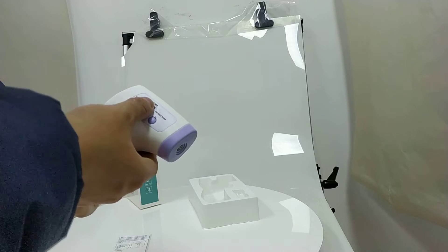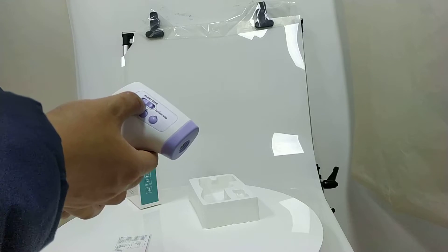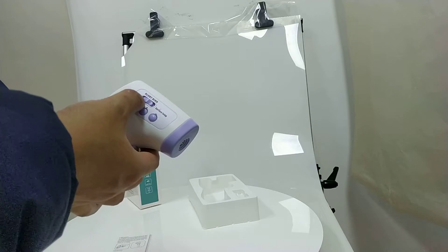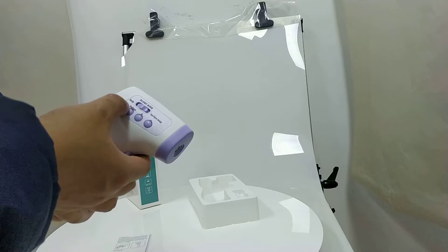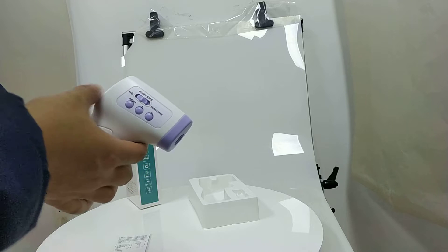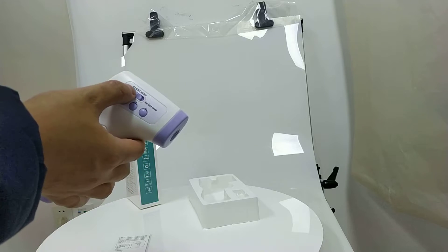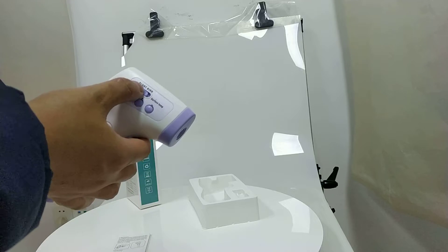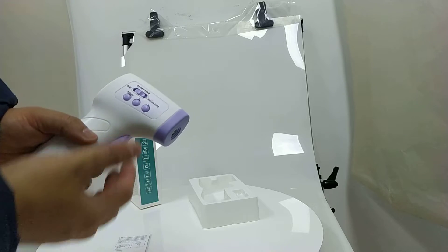And there are two positions of the switch. One is for body temperature. The other is for the surface temperature.